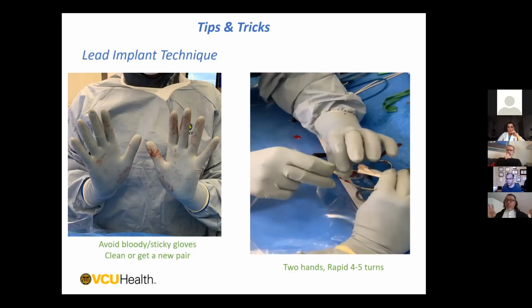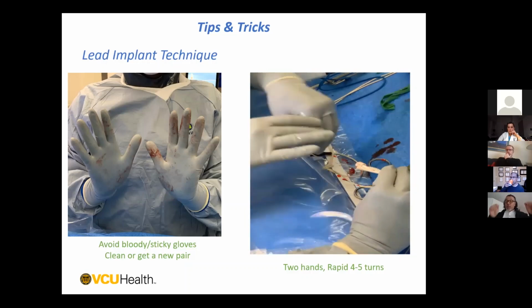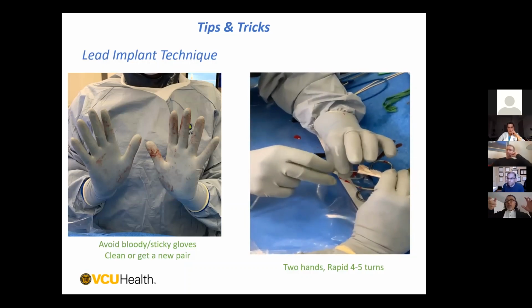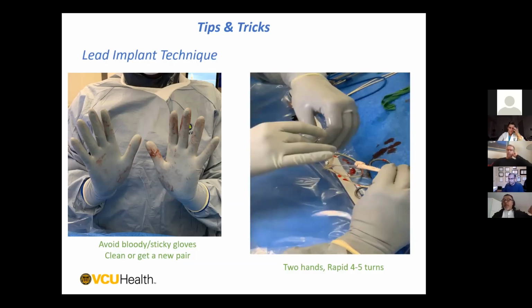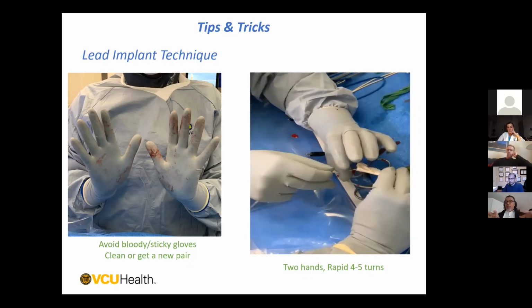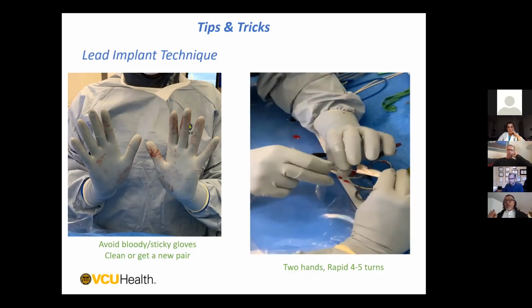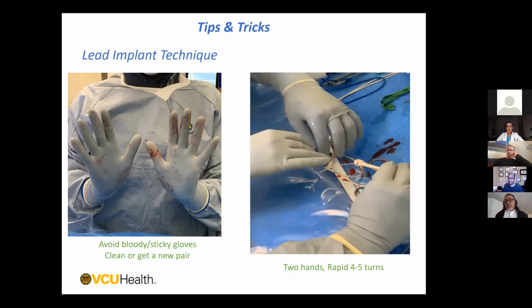I don't know why, but most of the time, if the lead is not advancing smoothly, there's something wrong. In most cases, I think I'm over-torquing and going too posterior, so probably just hitting the pericardium already. It should be smooth. When everything is fine, it goes fast, as you said, 5, 6, 7, 8 turns whatever, but with no turning back. That's what I've seen.